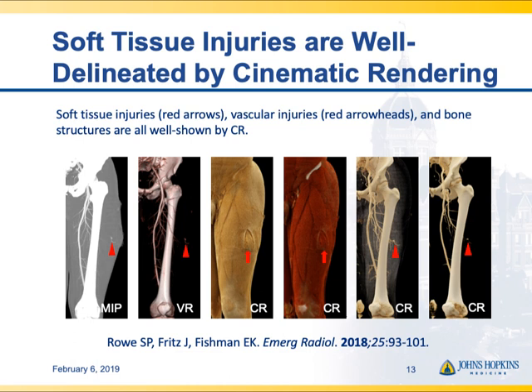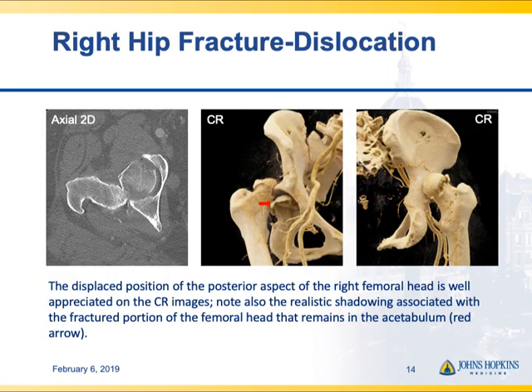Here's an example of a soft tissue injury. We practice in Baltimore where there are lots of penetrating traumas such as stab wounds and gunshot wounds. Here's a patient who was stabbed in the thigh. The MIP image on the far left shows a subtle vascular injury also seen on the volume rendered image, but with cinematic rendering you get nice soft tissue details showing the laceration through the muscle, without losing the visualization of the small vascular injury.